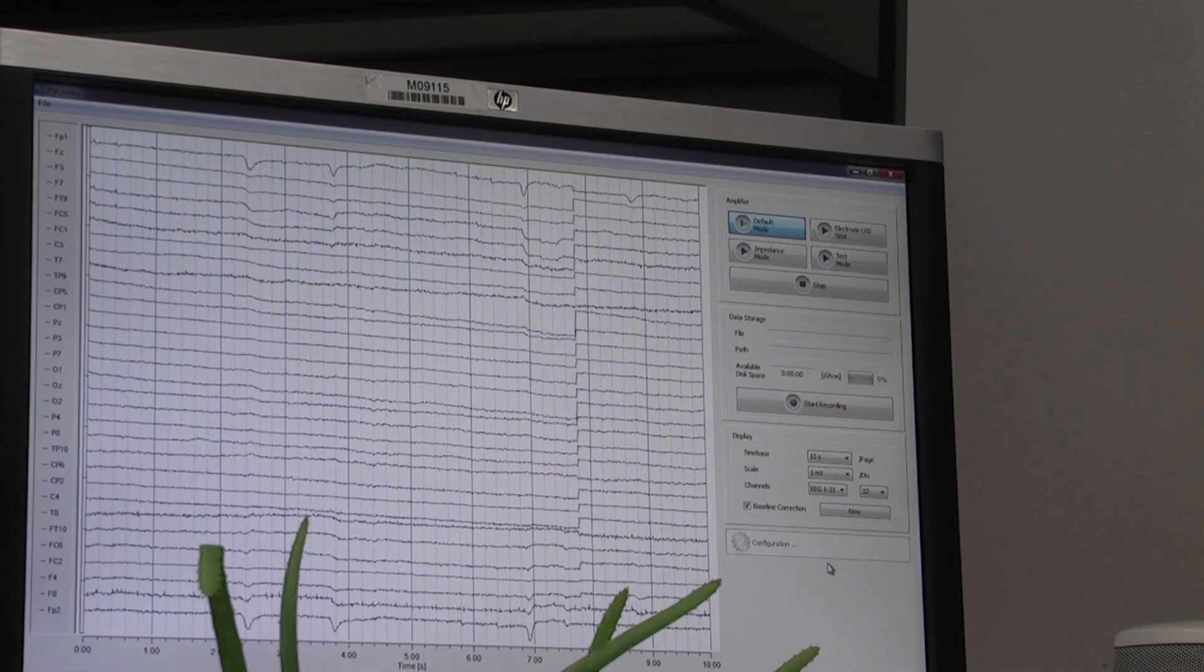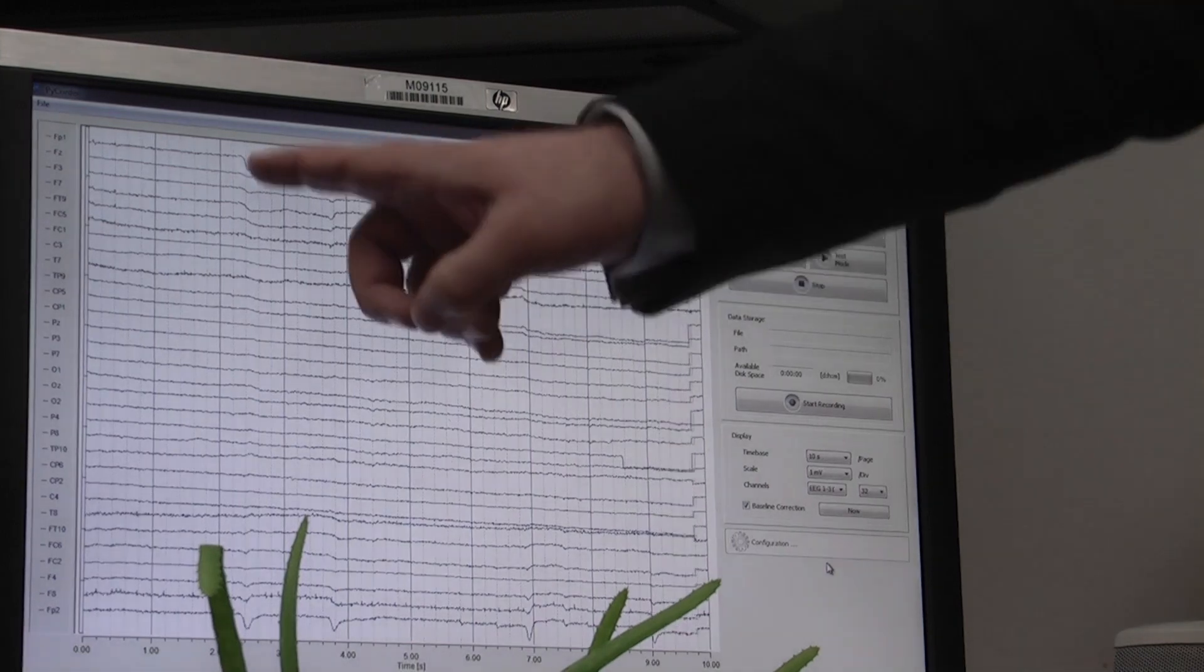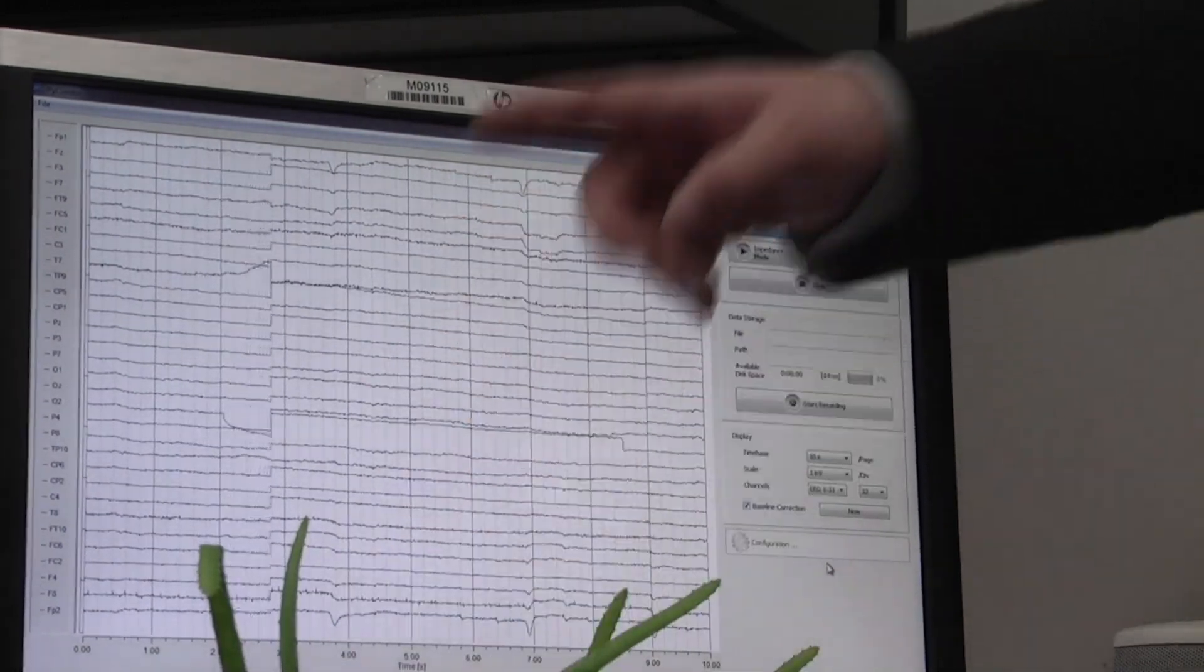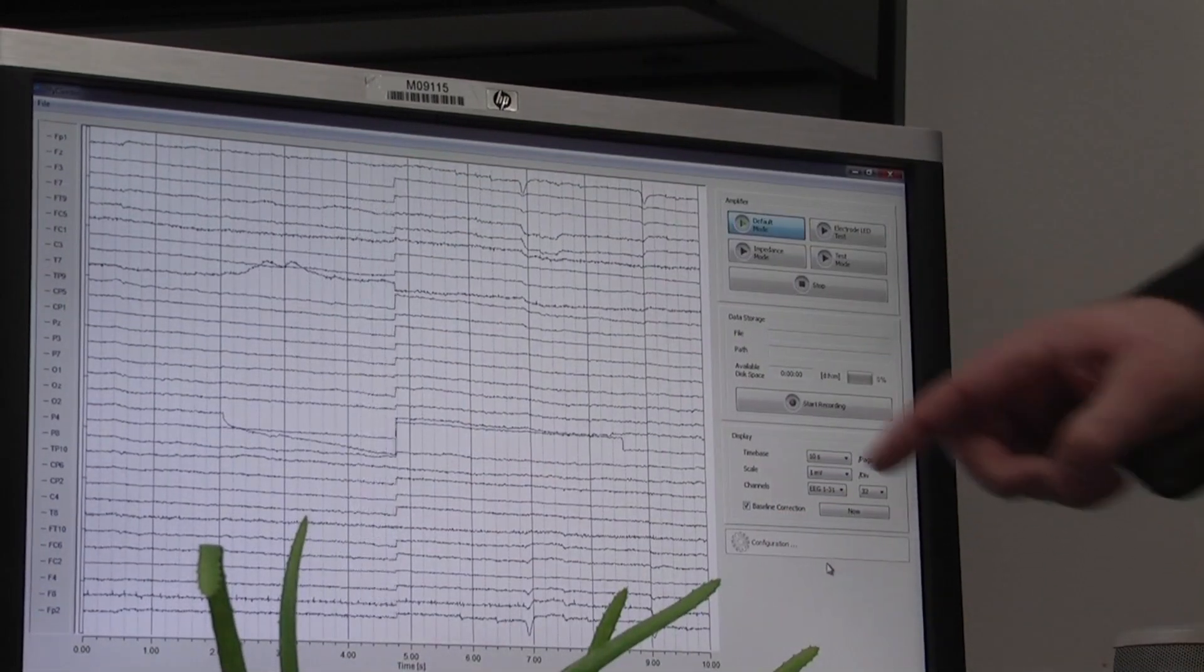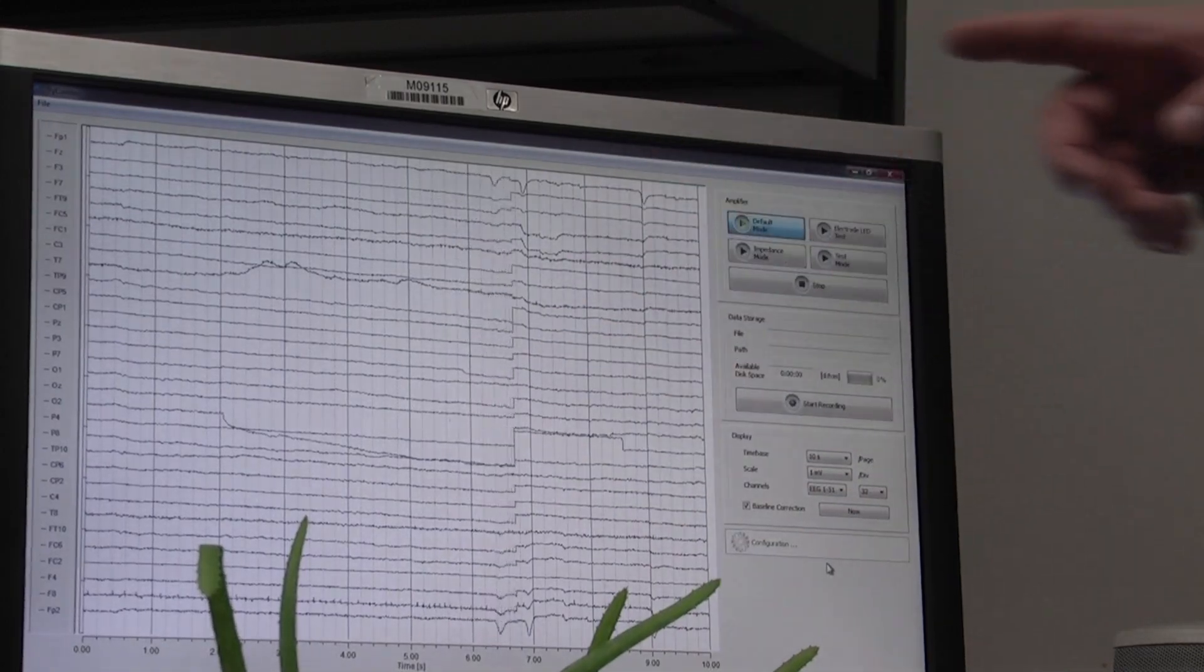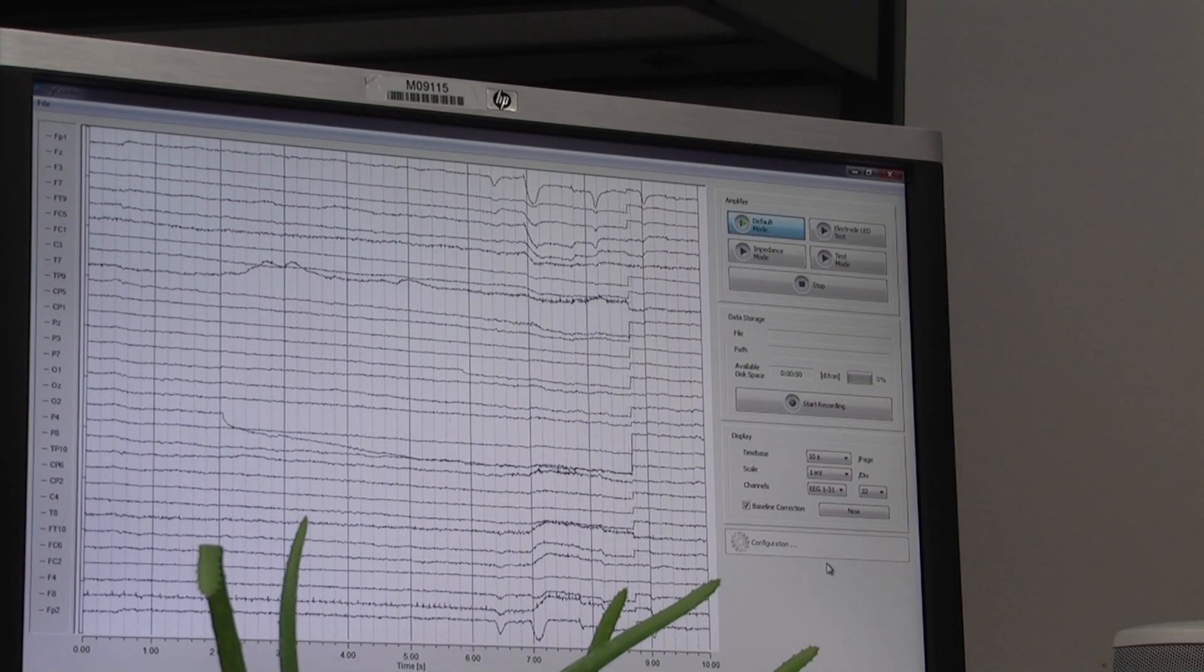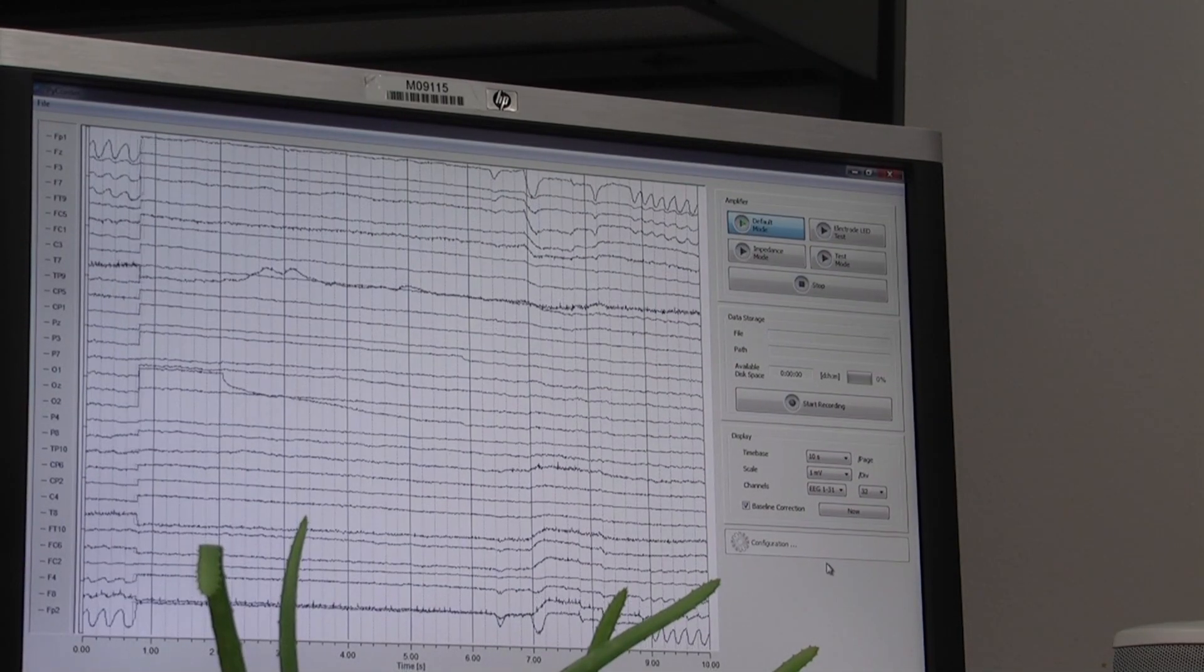The most important thing that you always see though, in the top channel and the bottom channel are very rhythmic beats. That's not the heart. Allie, look ten times in a row for me. Starting now.